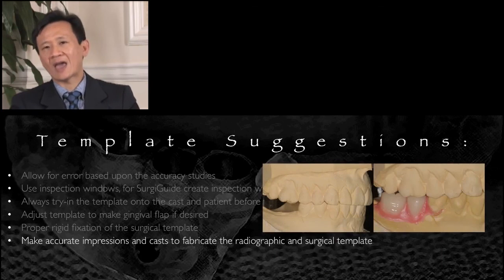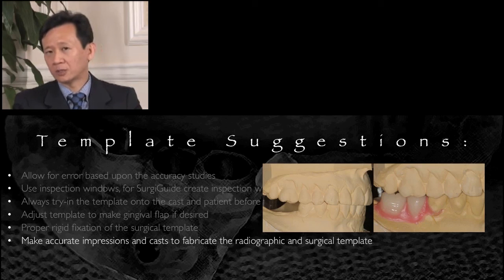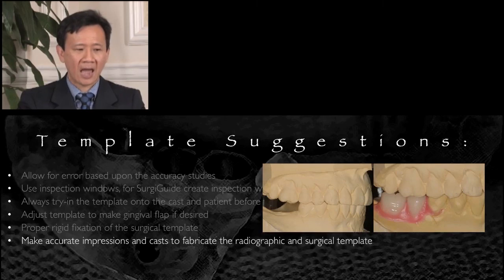And make sure that you have accurate casts on which to fabricate the radiographic template or the surgical template. Accurate casts and impressions.